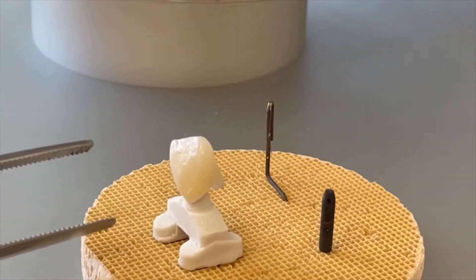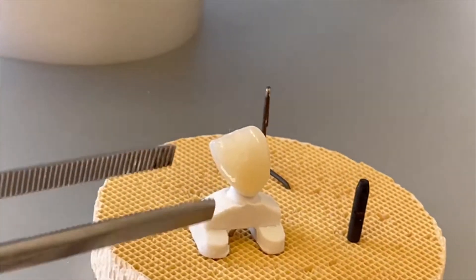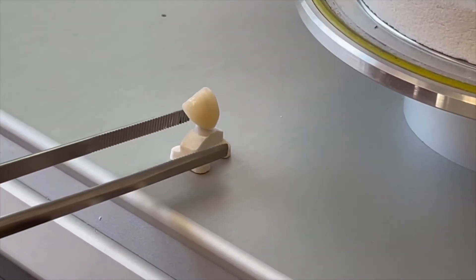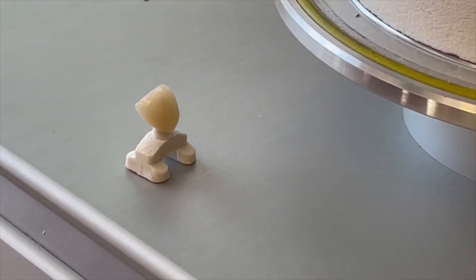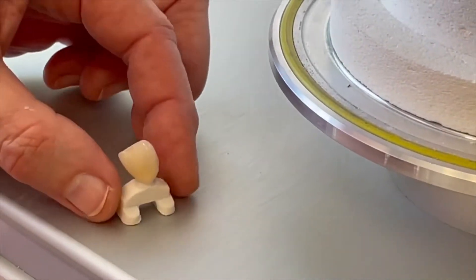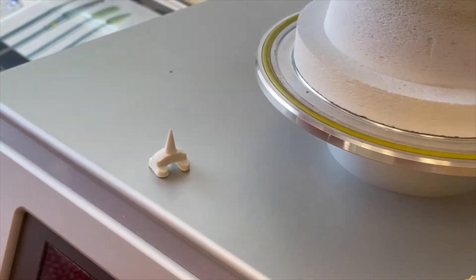Andrea shows us the crown, which looks very, very excellent after the first layering — only one layer. Now we have the last step: to go with the glazing.